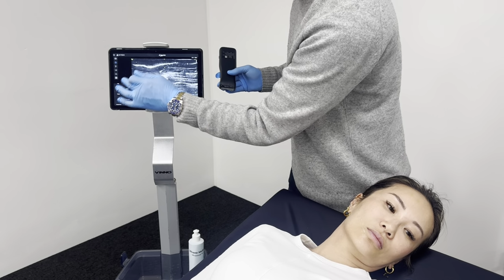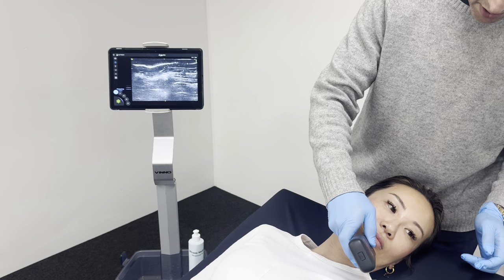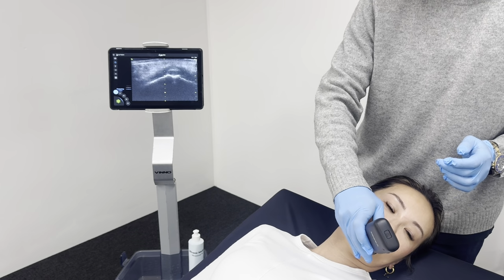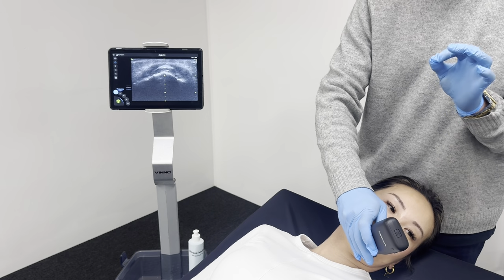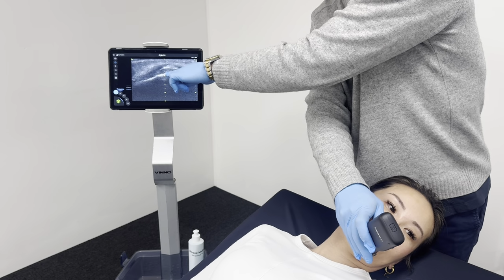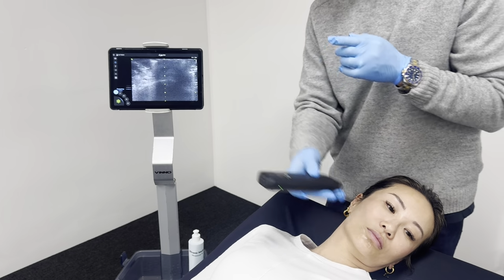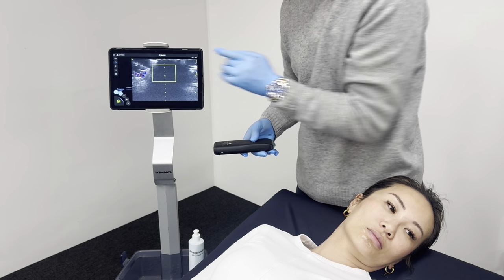So with the centre line marker on, we'll be able to put the probe right in the middle of the chin, and we'll be able to see on the ultrasound where the centre of the chin is. So you can see the bone usually has this little white fibrous fatty tissue, which is this little circle just above the bone here, and then you can put the colour flow on and have a look and see where the vessels are in relation to the center line.